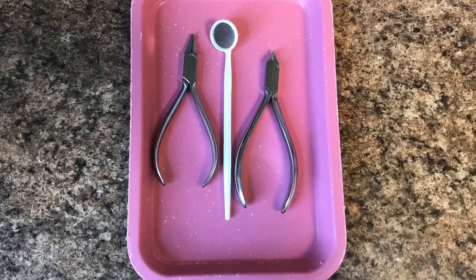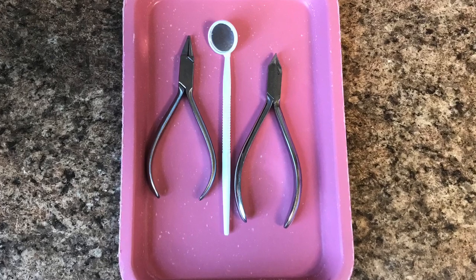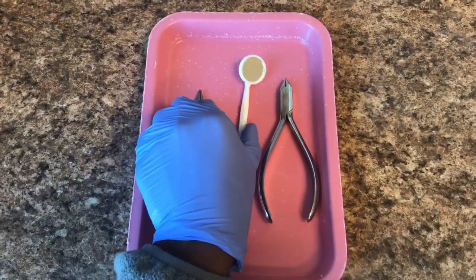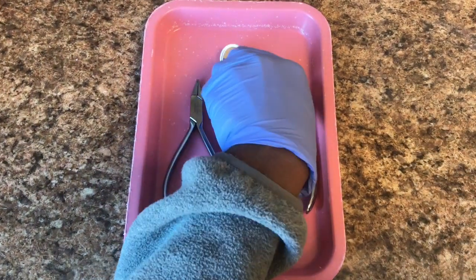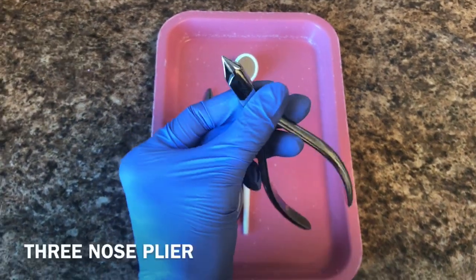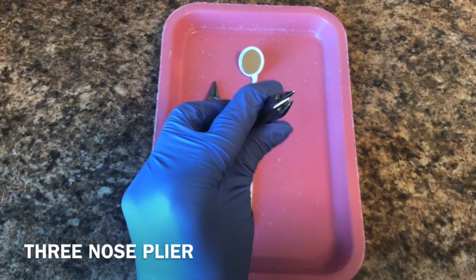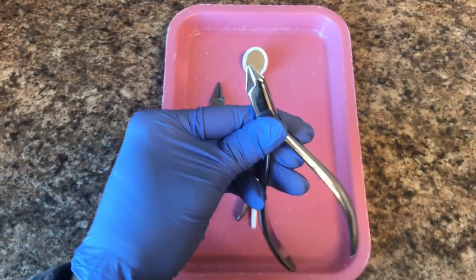So here we have your retainer tray. This is a tray used to adjust your retainer when you come in for retainer checks. We have your mouth mirror here and we have your three nose plier — if you look closely, it has three little noses. That's why it's called the three nose plier.